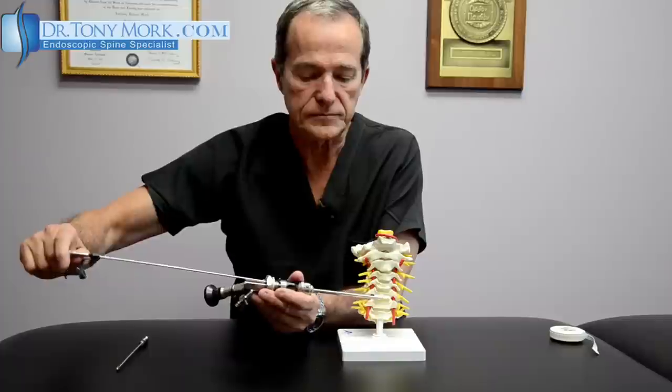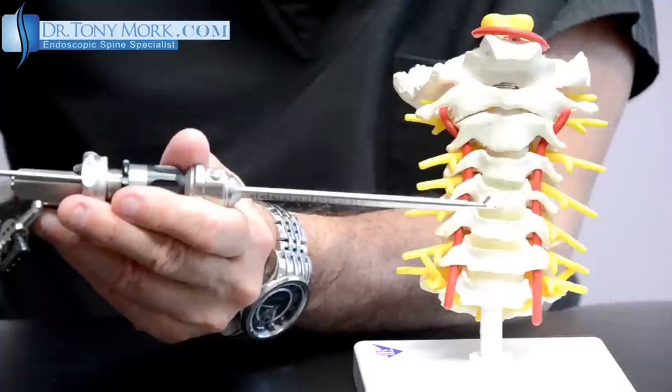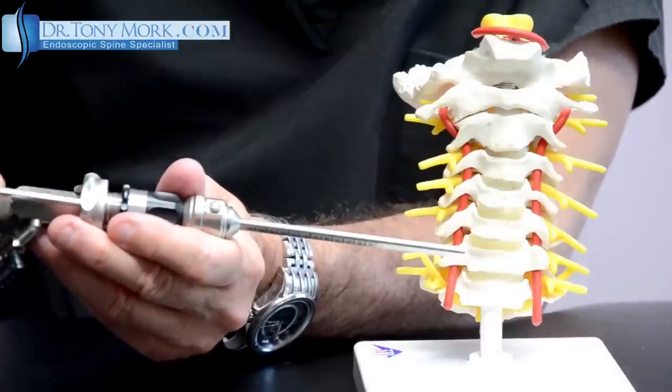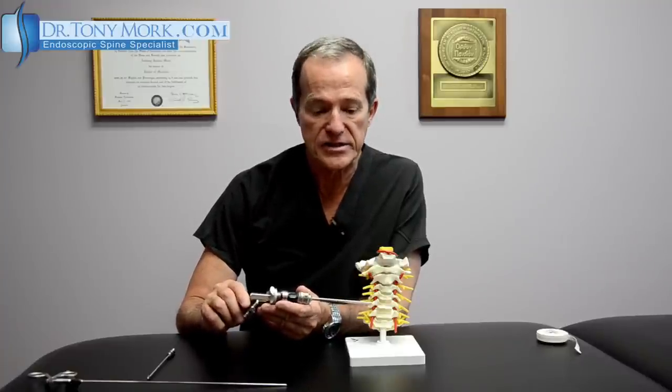We can put the instrument back in again to reach back in for more debris as necessary until all the fragments are removed. The idea is that a disc bulge or disc fragment can be removed endoscopically, sparing the remaining normal part of the disc without having to undergo a fusion. For a symptomatic disc in the cervical spine, this represents a significant breakthrough in instrumentation — a cervical discectomy that addresses the disc only and does not disturb much of the surrounding tissues.